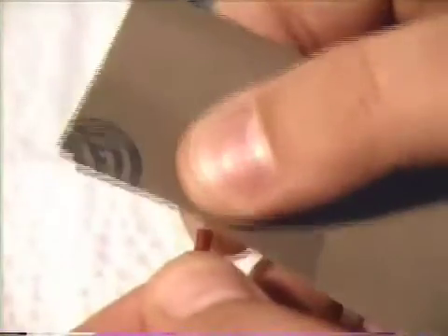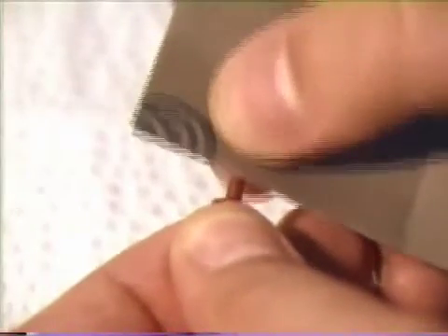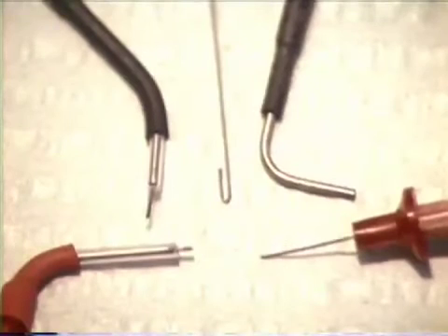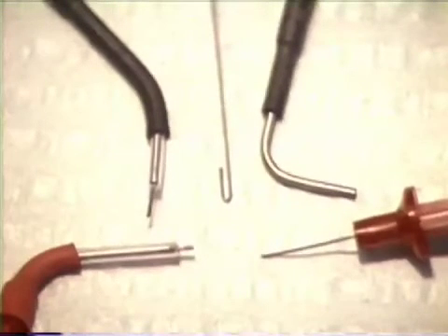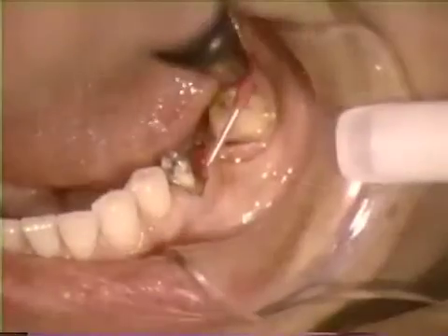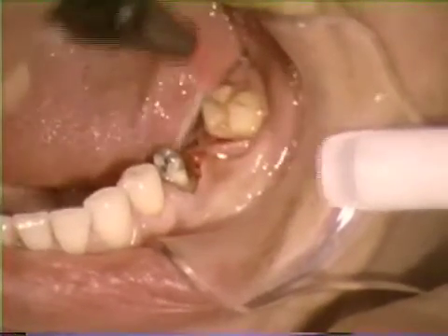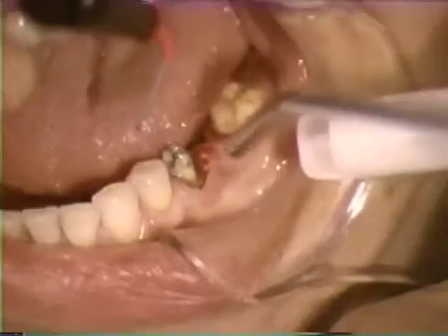Damage to peripheral tissues will be minimized and healing will be more predictable when the least functional amount of current is used. As a general rule, only fine wire electrodes should be used. The large diameter tip in the upper right display should be discarded.